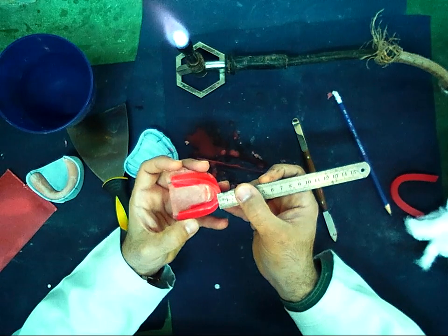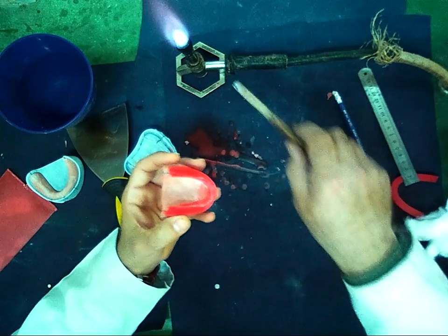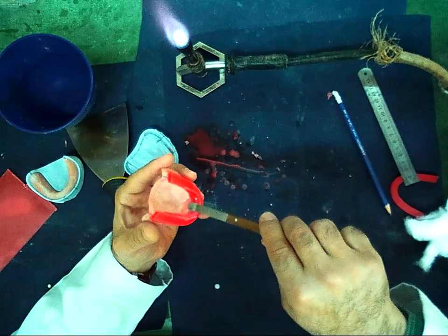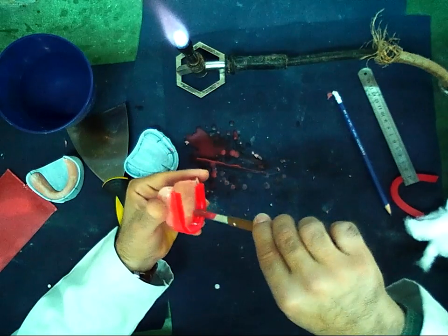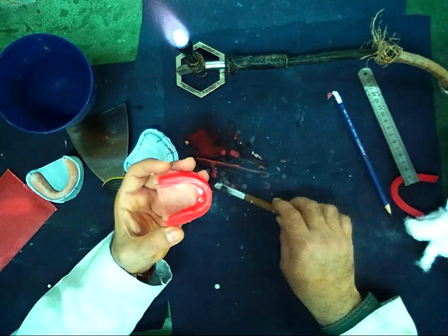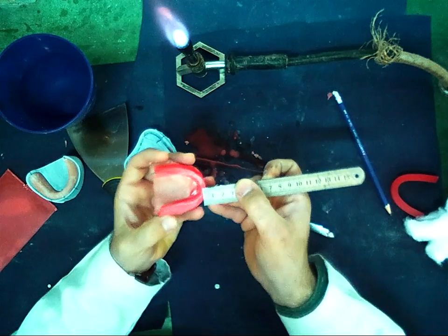Now it is 5. I need 4 mm, so I remove 1 mm more. Now it becomes 4 mm.